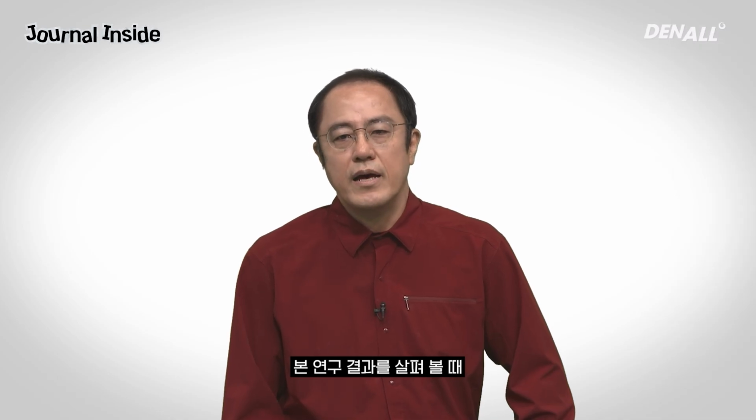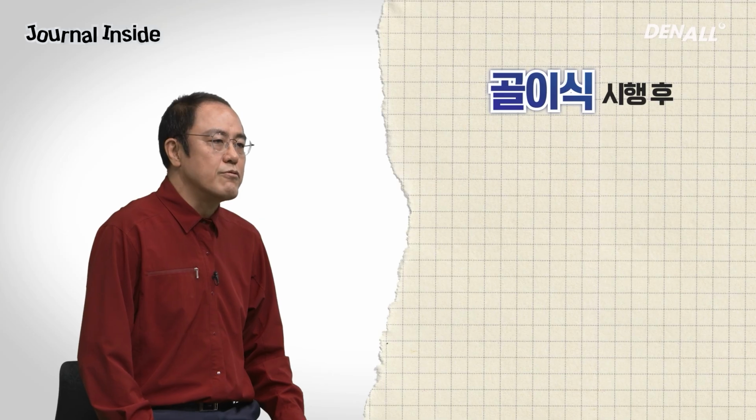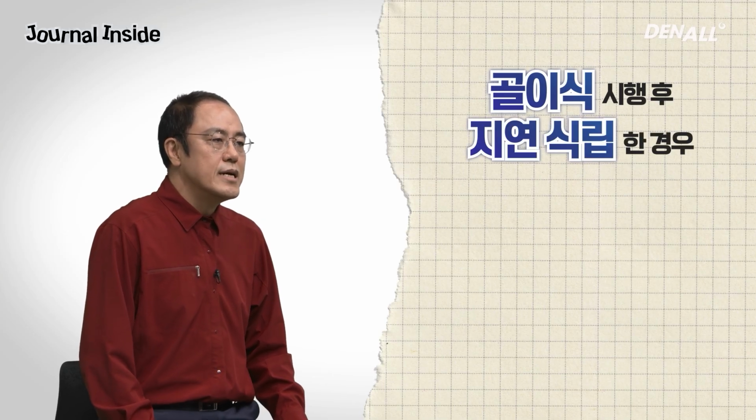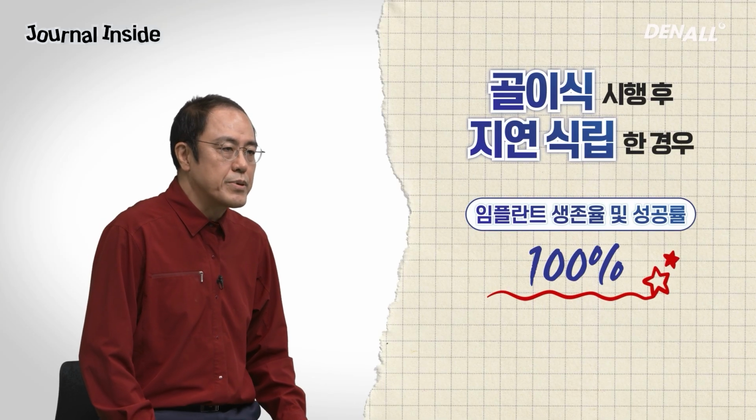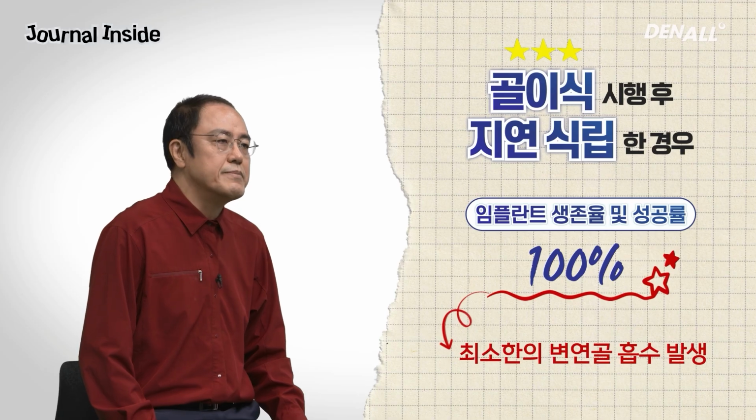The results of this study show that the survival rate and success rate were 100%, and marginal bone resorption rarely occurred when implants were placed after bone grafting was performed first and a sufficient healing period was given. Please use this meaningful data as a reference in your clinical practice.